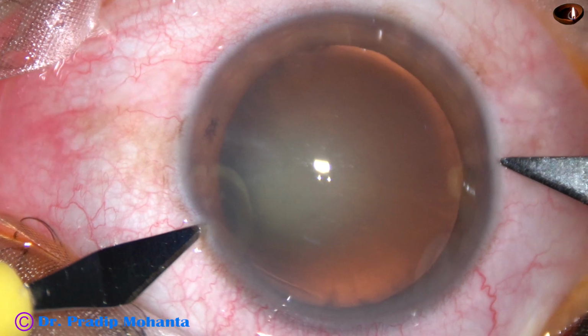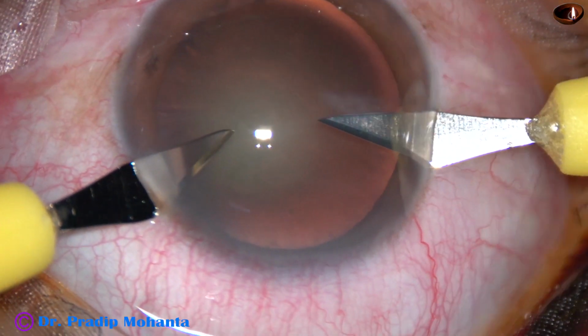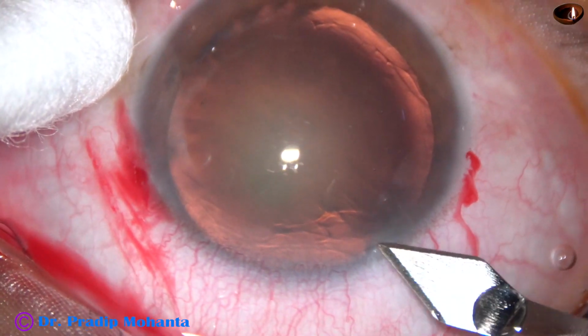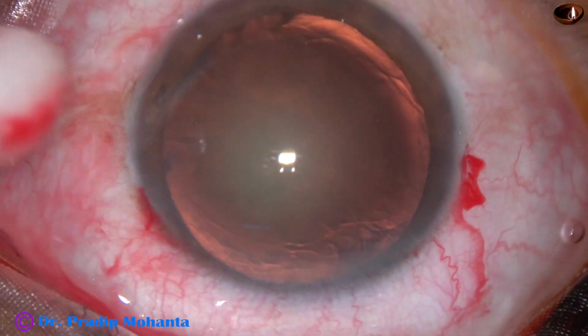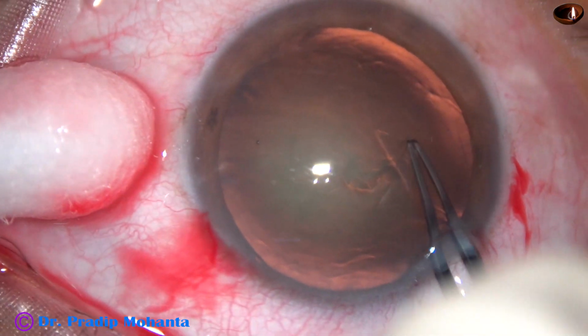And this is the lens tip knife. This is 1.6 millimeter. I gave this idea so that in one go I can make a side port through which a 23G Simcoe can go into the anterior chamber.